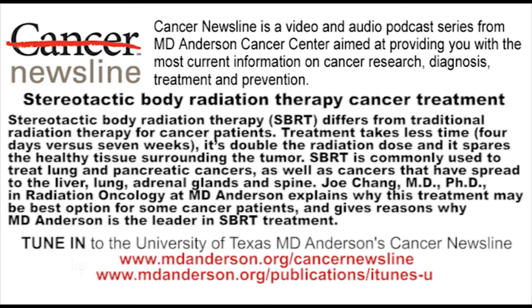And I think that's a distinction that people can't always make about radiation therapy. There are several different types. And so the stereotactic part is the imaging, where you're imaging the tumor site as you are doing the radiation therapy. Right. So you can actually use other types of radiation therapy in the stereotactic setting. Exactly. You can use proton, photon, IMRT, 3D conformal, different technologies, but use the concept of stereotactic, which means deliver ablative dose to the target and avoiding surrounding critical structure.